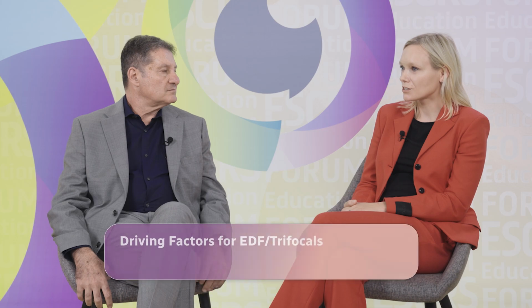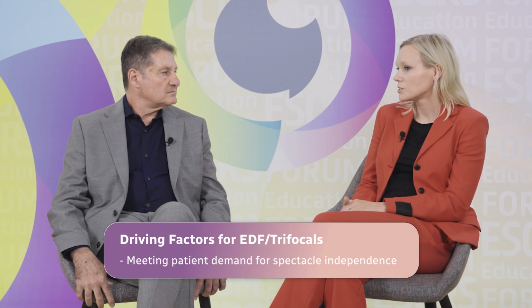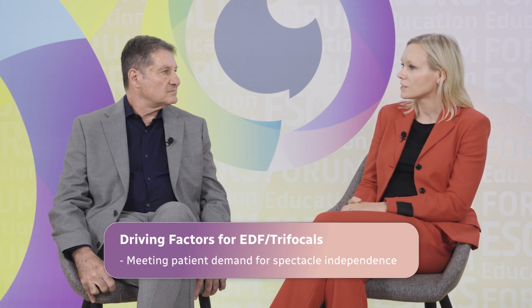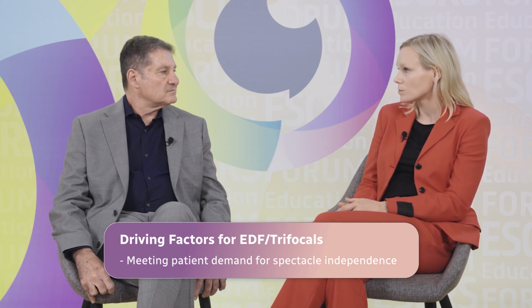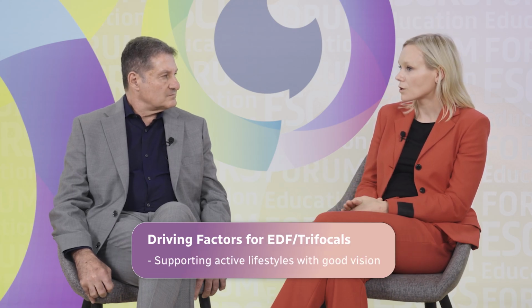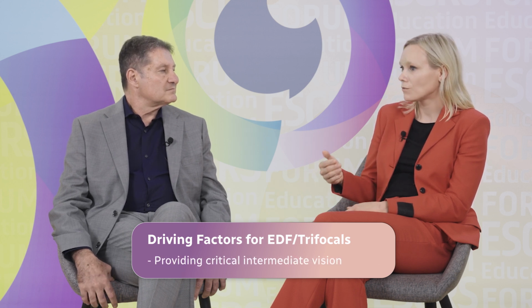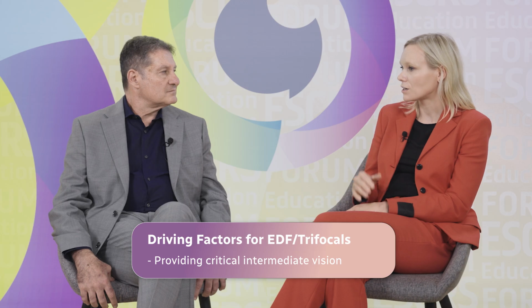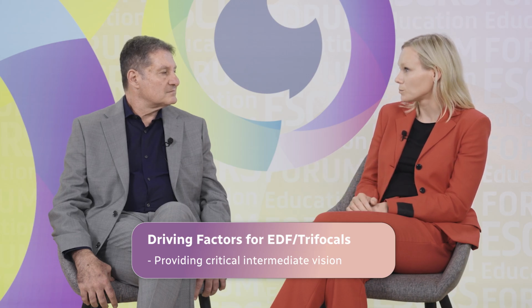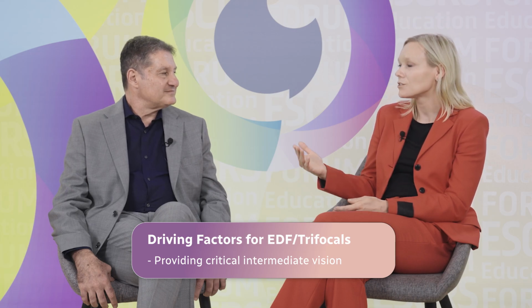So, Andrea, why do you think that trifocal and EDOF lenses have become the leading choices for presbyopic correction? The population is becoming presbyopic. The patients are searching for some solution to be glasses independent. And so that's why the trifocal lens or even the EDOF lens can bring them better vision and better quality of life, because patients and people generally are becoming more active even at higher age. And also the intermediate distance has become very important in our lives. The car dashboards, laptops, and smartphones, we spend hours a day sometimes. And this is something which makes us literally live in the intermediate.